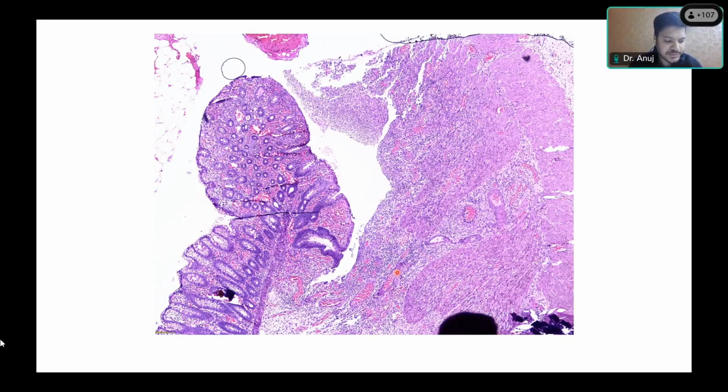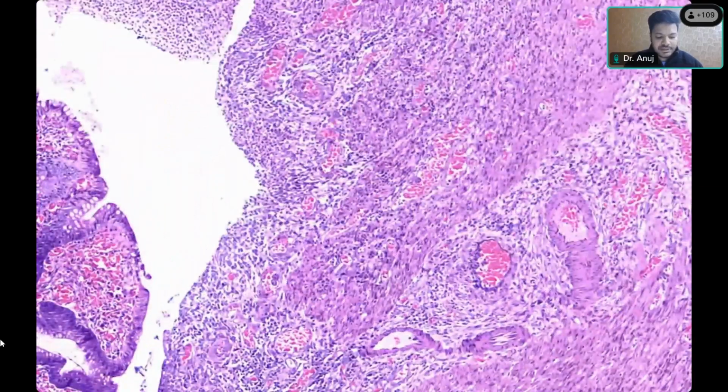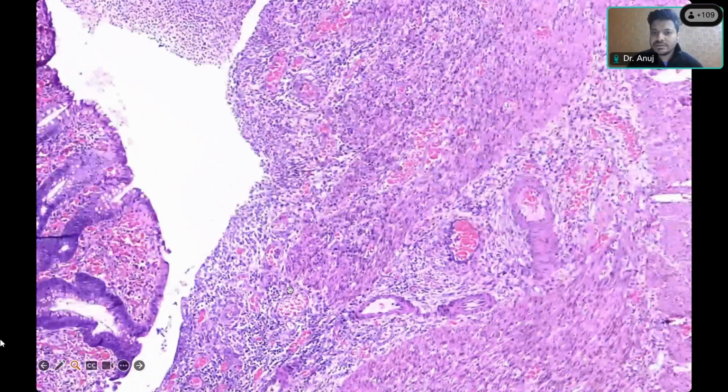Section 7 showed tissue pieces of colonic mucosa showing ulceration of colonic epithelium. Lamina propria shows a moderate mixed inflammatory infiltrate comprising lymphocytes, polymorphs, and plasma cells, along with congestion and hemorrhage. Focal cryptitis and crypt abscess are also seen, and a few cytomegalic cells with oval intranuclear viral inclusions are present. It is infectious colitis, that can be due to CMV. Okay, cytomegalovirus. Very good. Excellent.